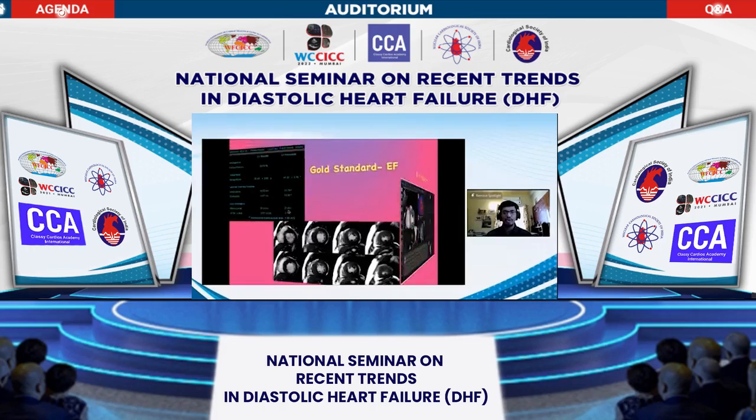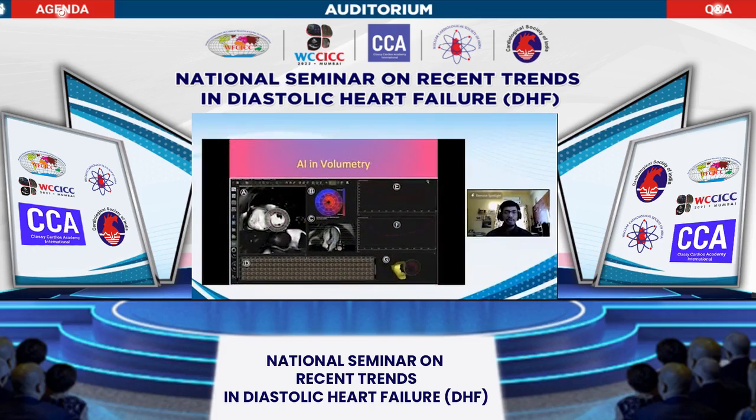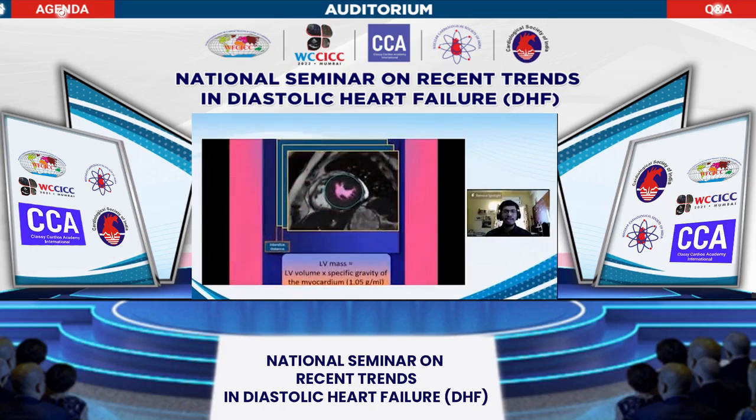and the stroke volume. And with AI coming to the picture, Dr. Prabhu gave a very good reference. You find that infinite number of sections can be taken, and you get a very good plot for the RV and the LV. And these are super accurate, and more importantly, over a longitudinal period of time, seems to be very accurate in recording the decrease or increase in ejection fraction in these patients.